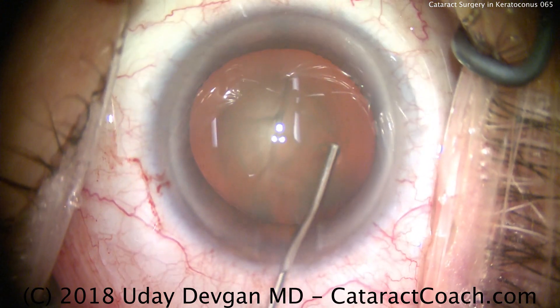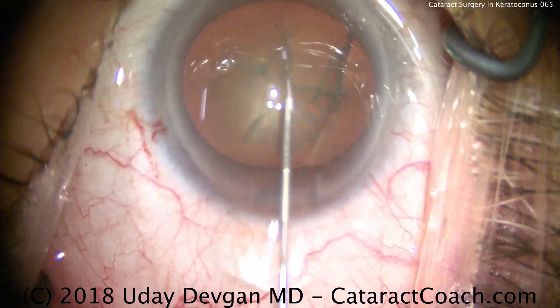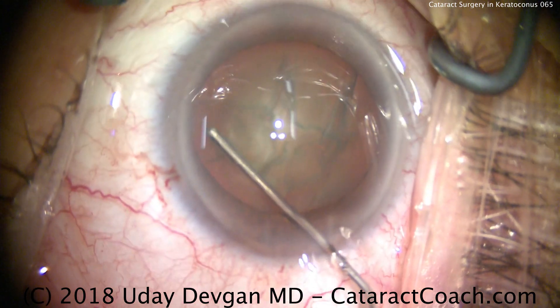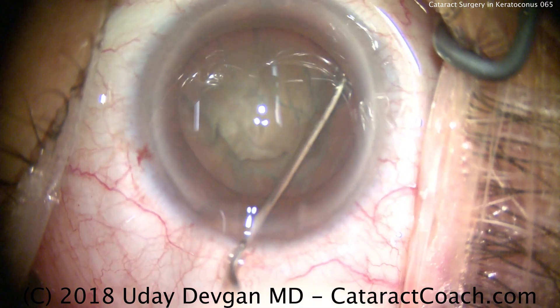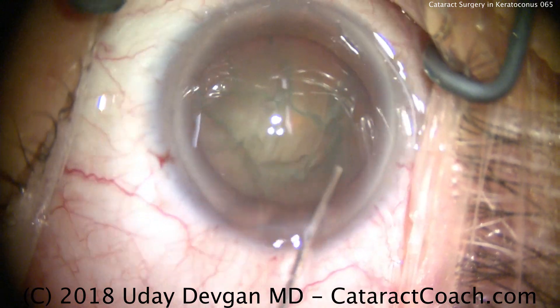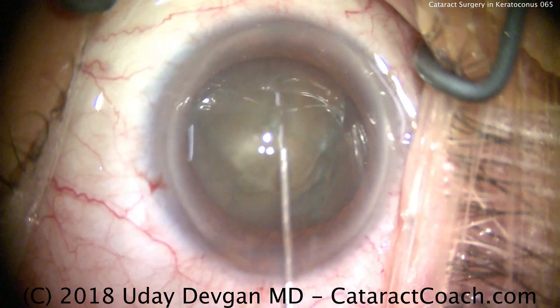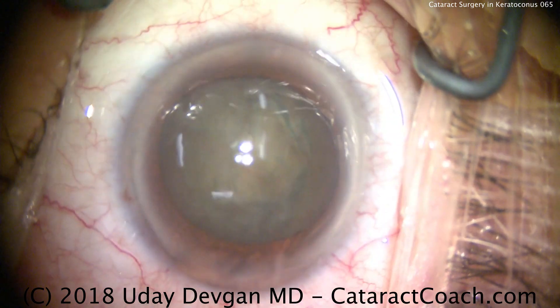We'll use balanced salt solution on a blunt cannula to do hydrodissection. You'll see the fluid waves go across — there's one fluid wave. Tap the center of the nucleus; here's another fluid wave. Tap it again — another wave. You definitely want this nucleus to be freely rotating. Once I have enough fluid waves to loosen it up, let's see if I can rotate it. Yes, it rotates beautifully.